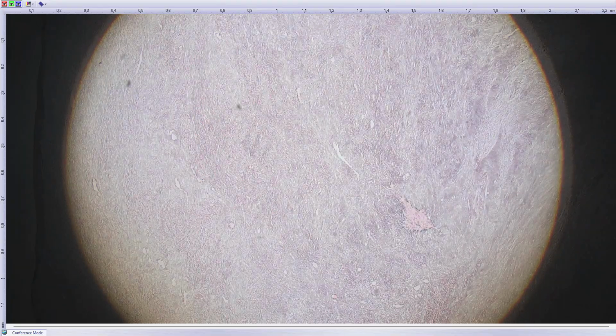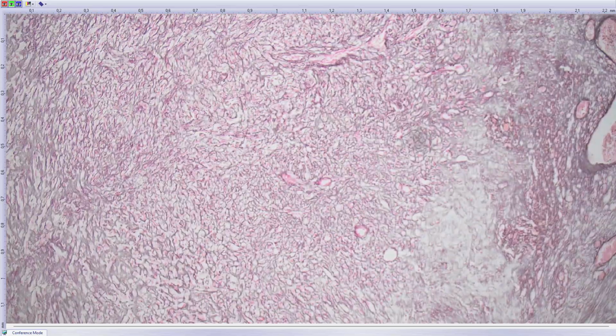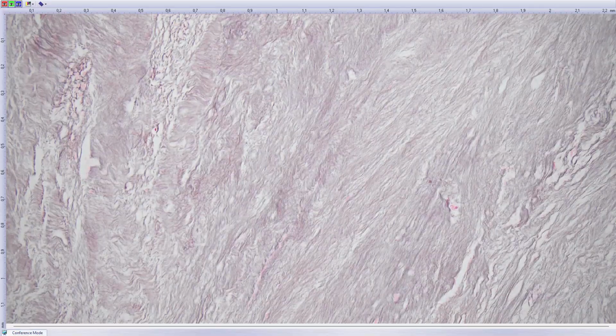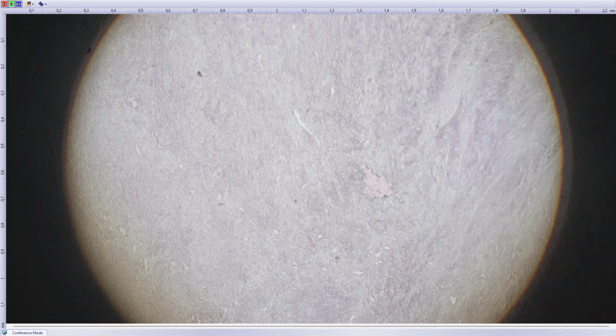Another one is reticulin stain. So this is Gomori. And in the normal viable parts, you can see this pericellular accumulation of the fibers. And if you go into necrosis, you completely lose this meshwork, basically, around the cells, which would be another feature in favor of this hyaline necrosis or non-tumor necrosis.